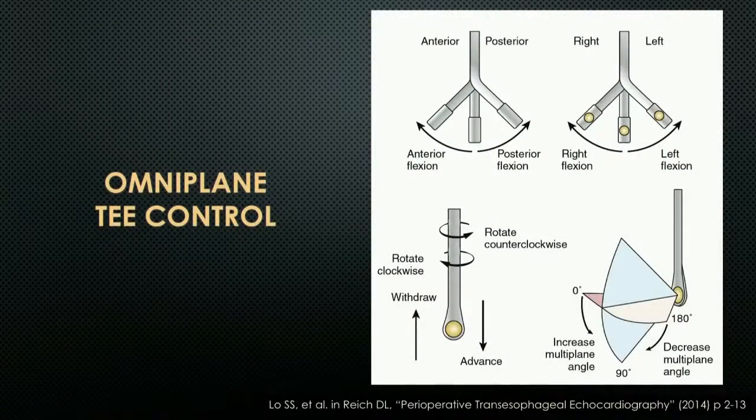So our TEE probe, we've got it in there. The patient is moderately sedated. They're maintaining their consciousness to a degree that's appropriate. Now let's switch to the probe and the imaging itself.